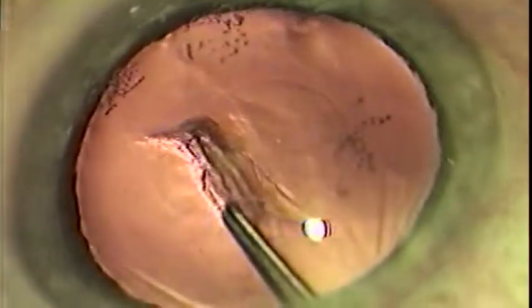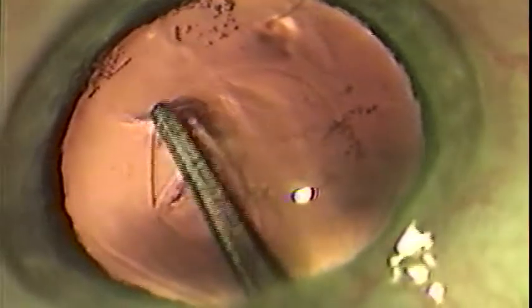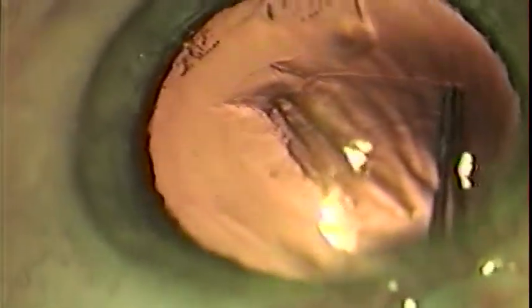If the tear should go in a direction other than the one which you desire, re-grasp the tear right at its leading edge and redirect it towards the center. You may re-grasp the flap as many times as you wish to affect the desired capsular opening.